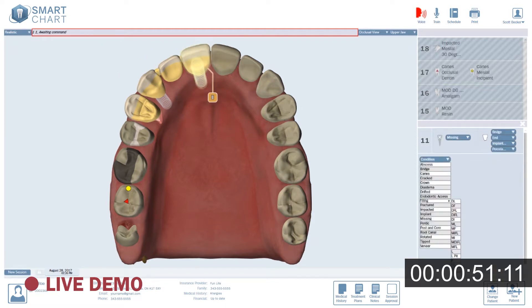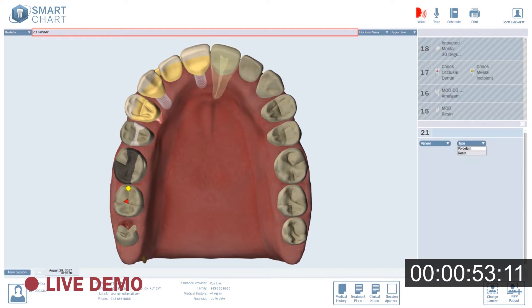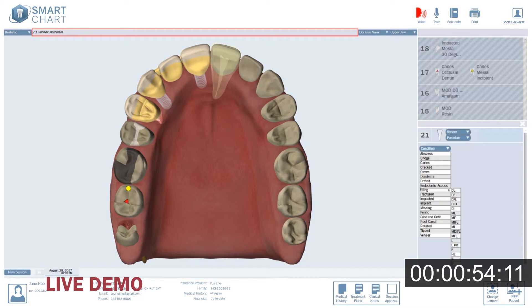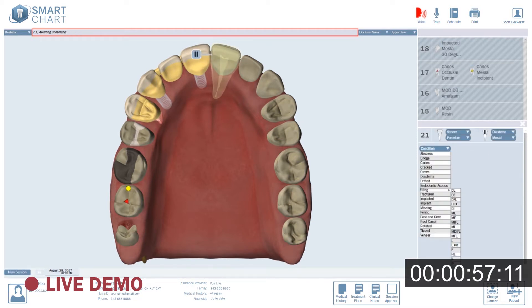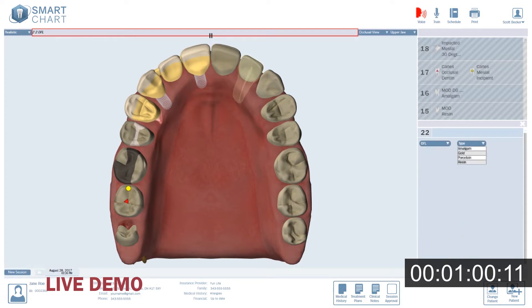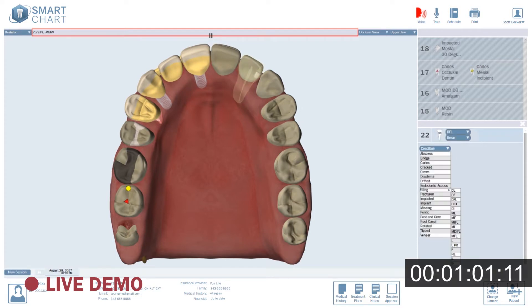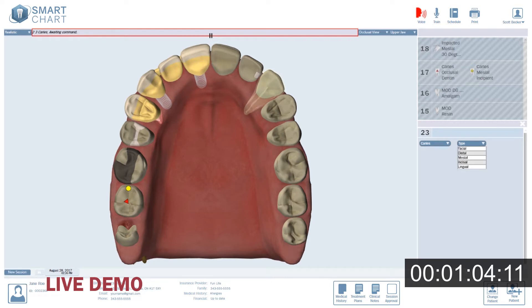2.1: Veneer, porcelain, diastema, mesial. 2.2: Distal facial lingual, resin. 2.3: Caries, mesial, incipient.